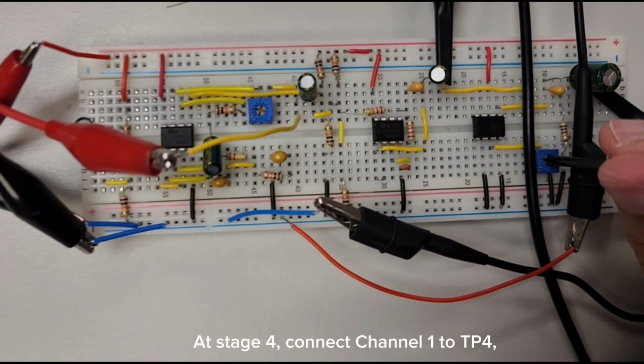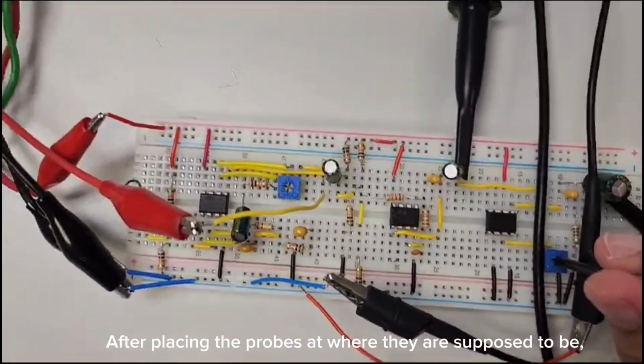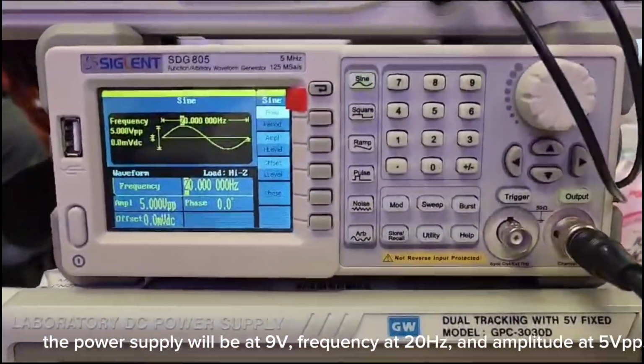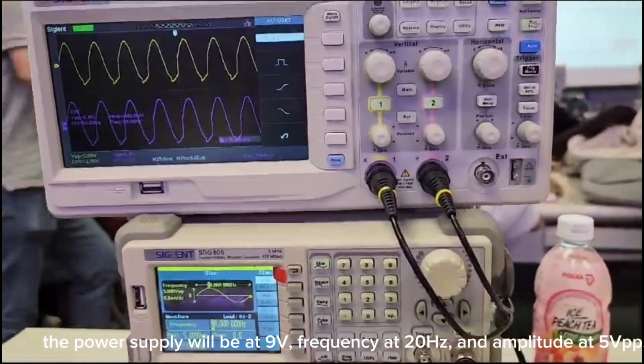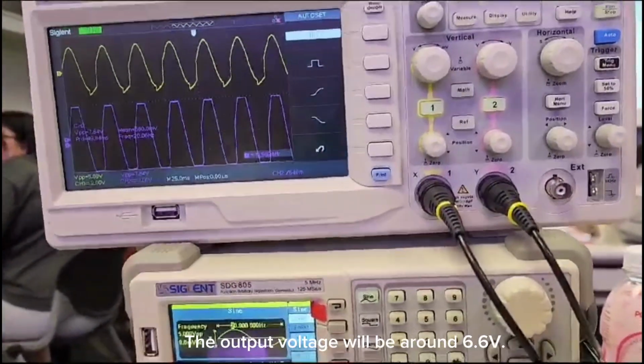At stage 4, connect channel 1 to TP4 and channel 2's probe of the oscilloscope to TP5, leaving everything untouched. After placing the probes where they are supposed to be, the power supply will be at 9 volts, frequency at 20 Hz, and amplitude at 5 volts peak to peak. The output voltage will be around 6.6 volts.